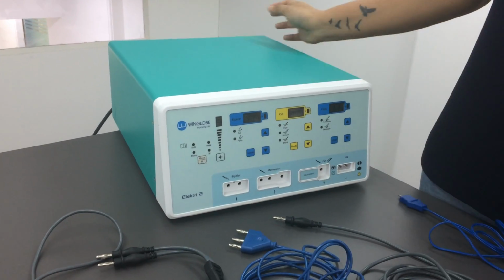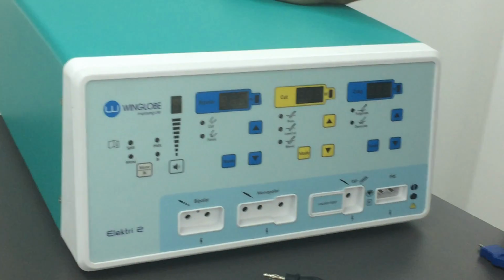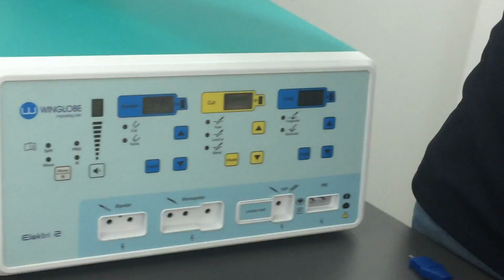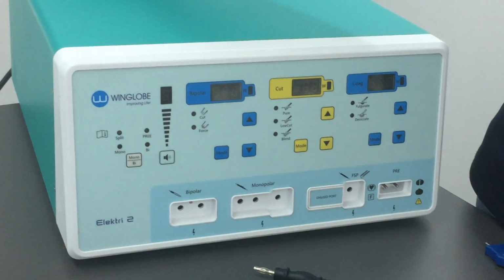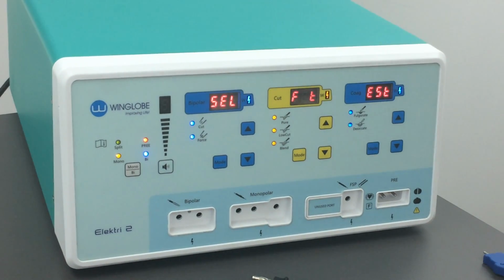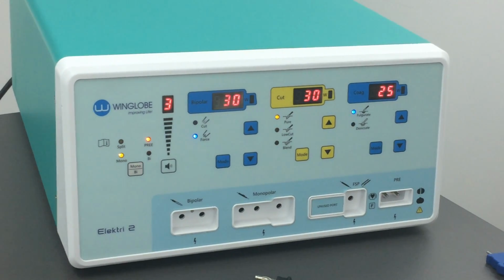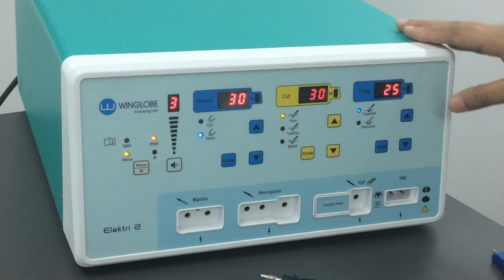Hello everyone, today we'll be taking you through a demonstration of Elektriz, which is the electrosurgical unit from Winglobe. Our power button is at the back, so I will just switch the machine on and wait for it to completely be ready. So we will take you through the screen first.